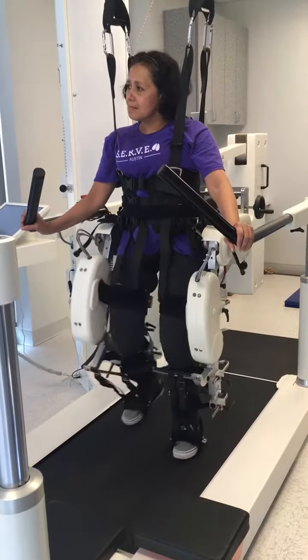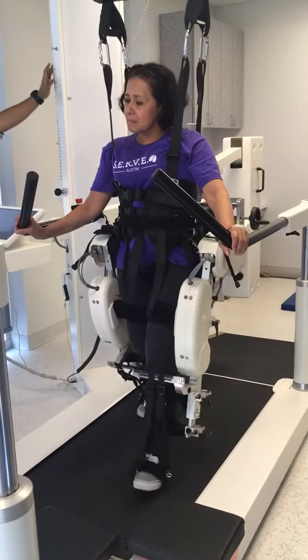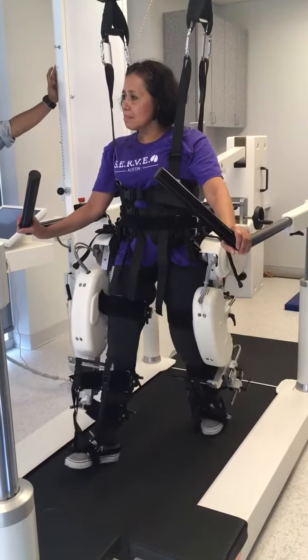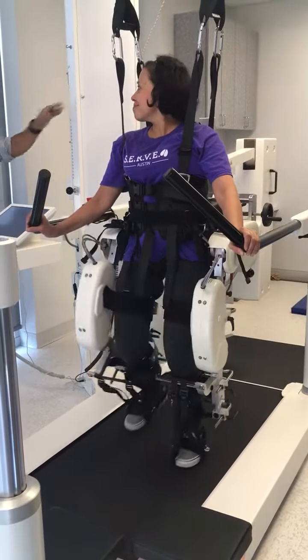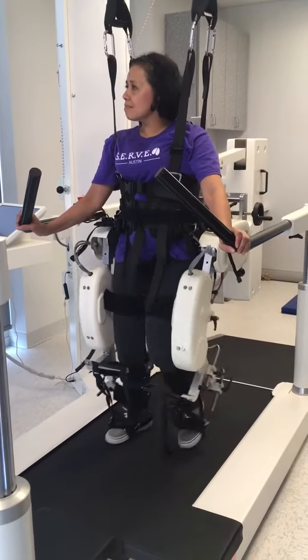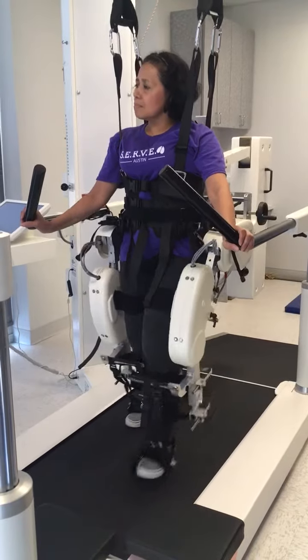Where I can see that the full range is going to be misreported. If I'm higher than that, then I have full body weight support, so it's not working. If I'm lower than this, then she would have all her support and all the slack is gone — it's like this is coming all the way down. Does that make sense to everybody, how that's working?